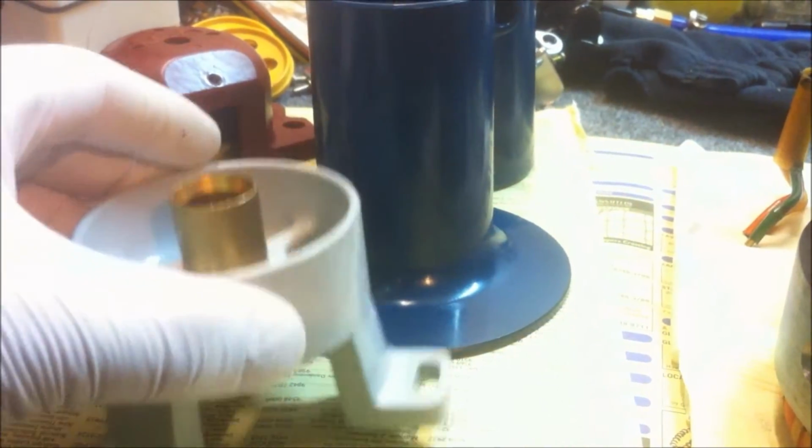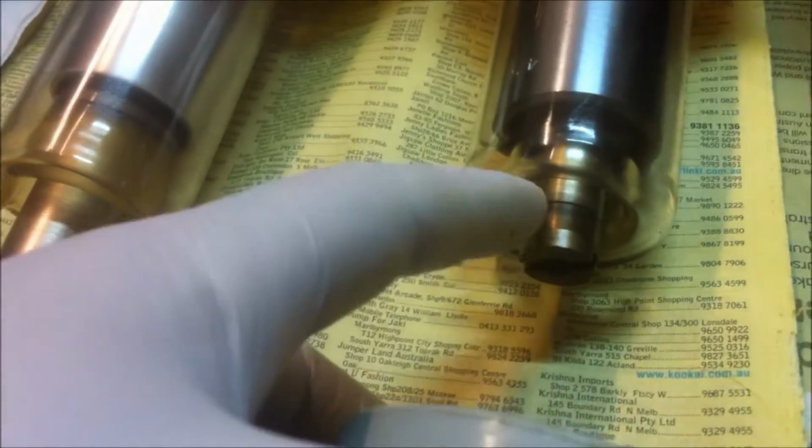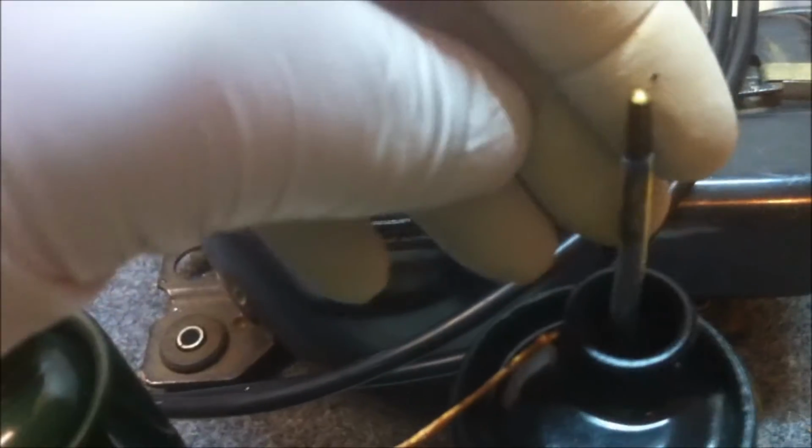So if I take in a bit closer over here, you can see that I've got a few other bits and pieces that I've kept. This one here is the base that the X-ray tube actually sat into, so the X-ray tube fitting here would actually sit inside this brass fitting, and through that hole there we would have this high voltage lead going straight into that hole, making connection with this brass fitting, which in turn connects to this rotating anode here.